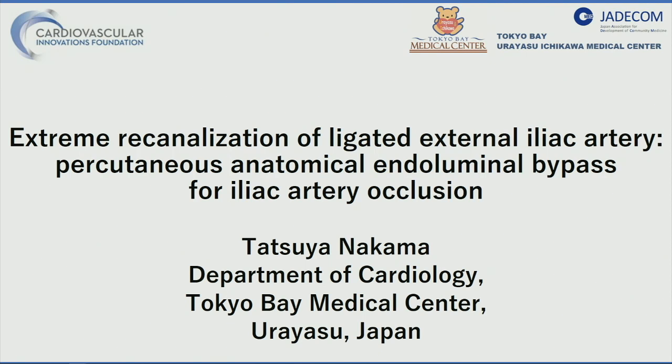Any others? What size stent was used? What size Viabahn was this? 8 millimeters. 8 millimeter. How do you manage the antibiotics after this?